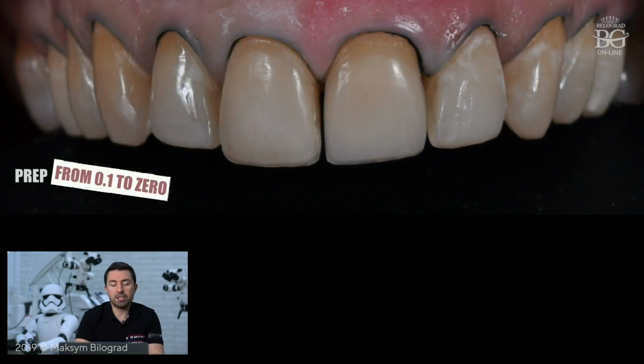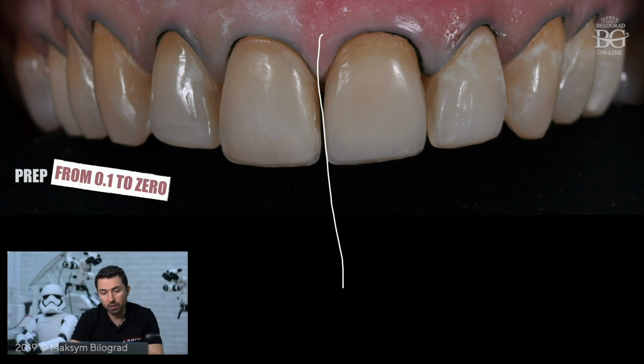Okay, so let us take a look at the final preparation. As I mentioned, due to composite restorations and caries defects, we made type 2 and type 3 preparation. Here is type 3. Between the central incisors we open the interproximal area completely. Type 2 preparation here and here. And canines were prepped for type 2 preparations as well because of small class 3 caries defects.